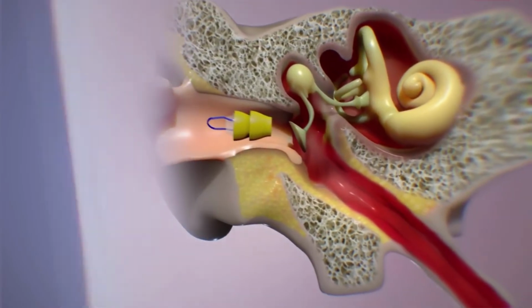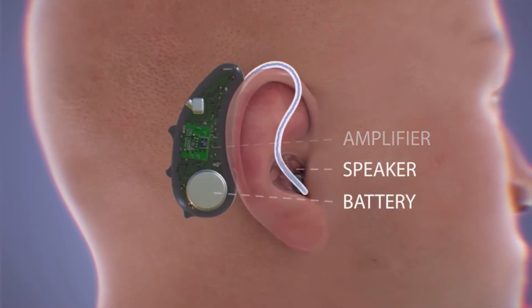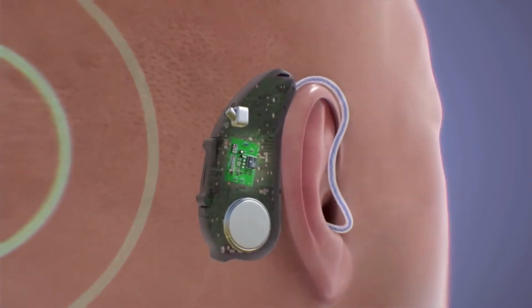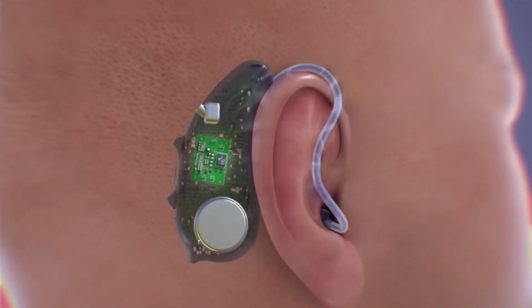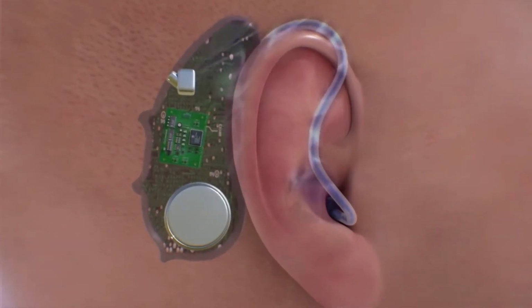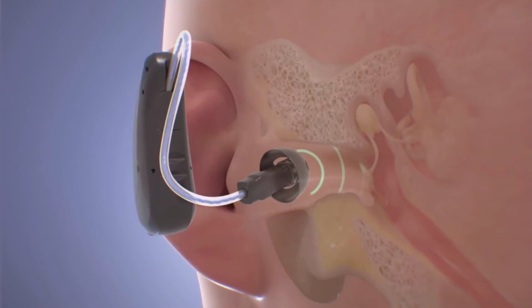While the style may vary, all hearing aids have the same basic parts: a microphone, amplifier, speaker, and battery. Here's how they work. First, the microphone picks up sounds from the environment. Then a computer chip with an amplifier converts the sound waves into electrical signals. It analyzes and adjusts the sounds based on your hearing loss and the level of other sounds around you. These amplified signals are then converted back into sound waves and delivered to your ear through the speaker.